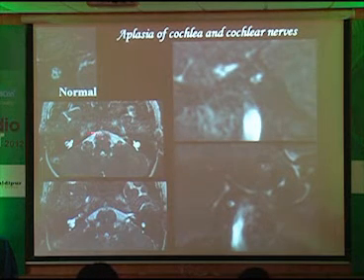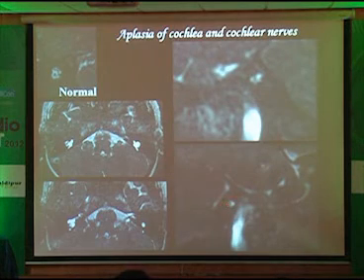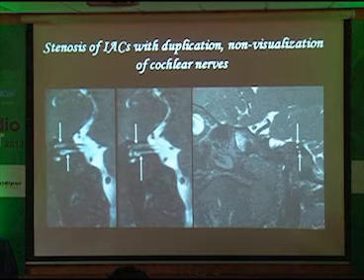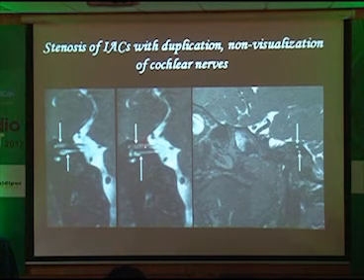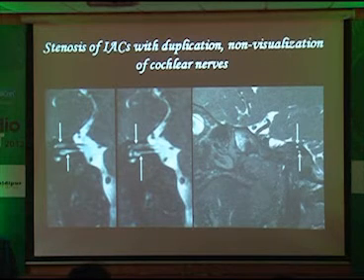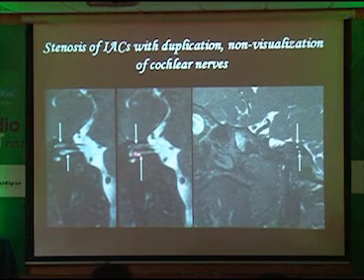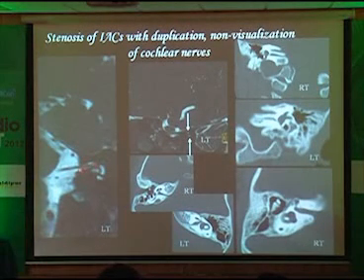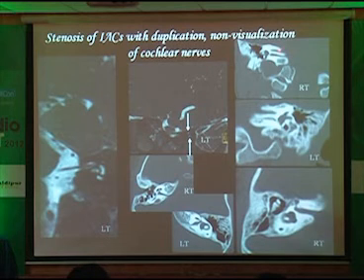In this patient there was no cochlea and no cochlear nerves at all — a case of aplasia of the cochlea and the cochlear nerve. Another patient had duplication of the internal auditory canal (IAC), with only one nerve going into it. You can see the duplication beautifully: one canal above, one canal below — classical IAC duplication, where the facial nerve goes into one foramen and the vestibular into another.